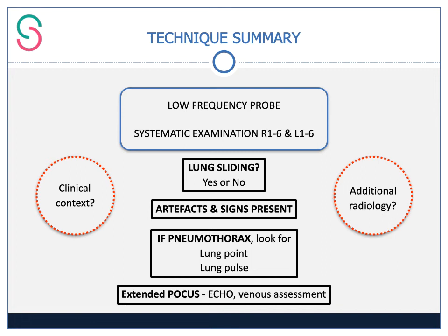If you suspect a pneumothorax, you need to go through an algorithm asking yourself, do I see lung sliding? Do I see B lines? Do I see a lung point or a lung pulse?